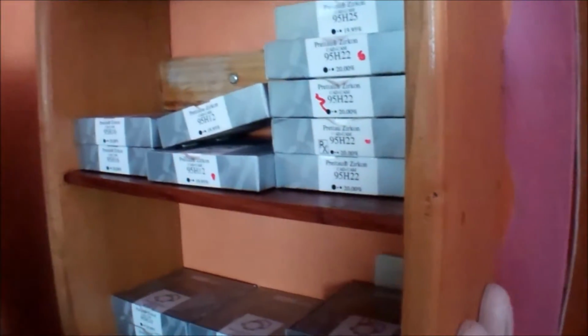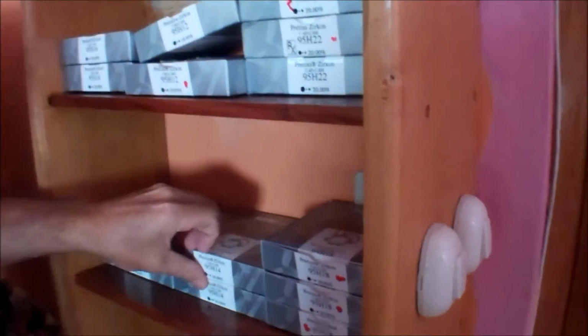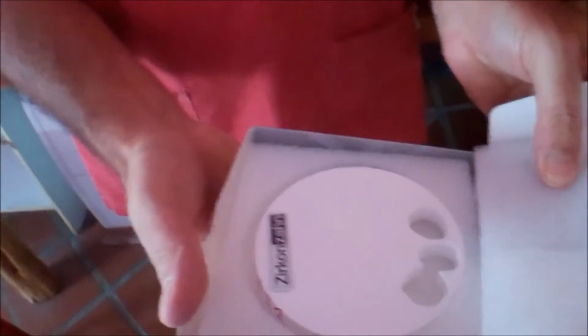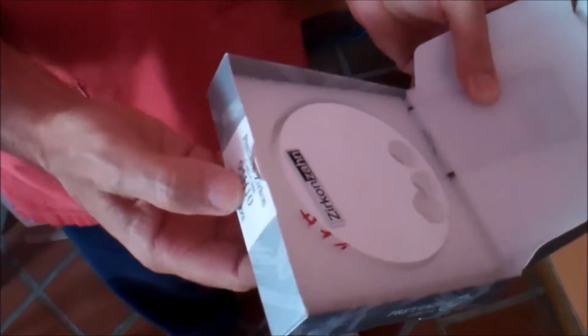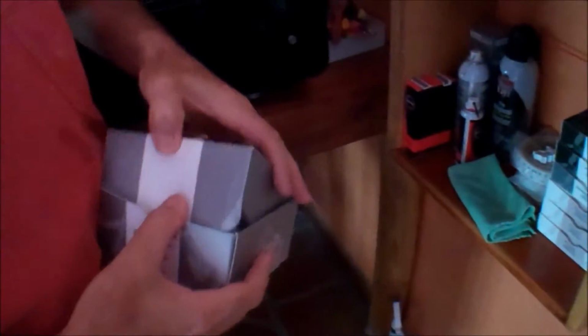Could we see what a blank block looks like? Or does it mess it up to open it up? No, I can show you some used ones. This is one size. What, about an inch thick or 3/4 of an inch? Yeah. Then you can get a big case of implants, something like this. It's going to be 30. It's very high. This is when you have a particular case. Wow, that's a thick one.